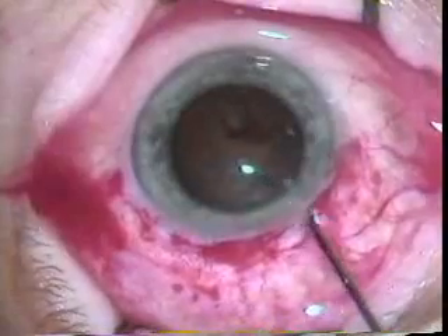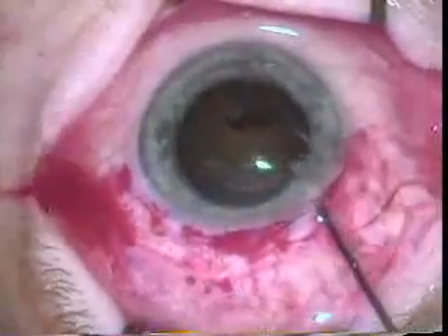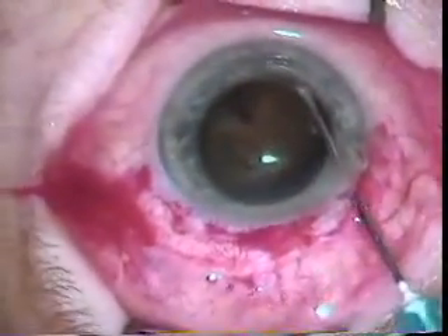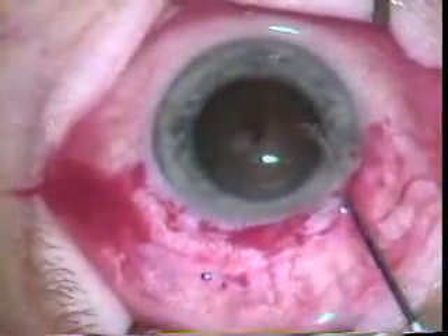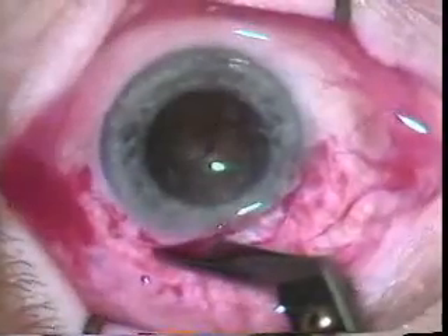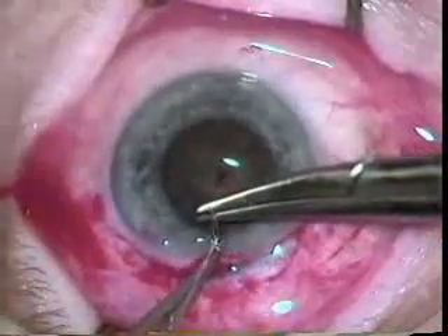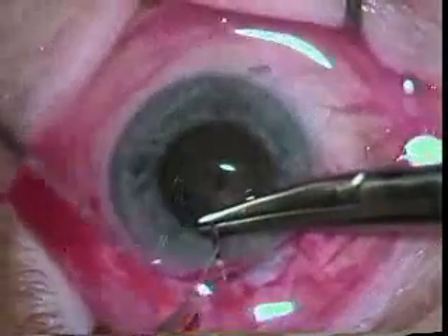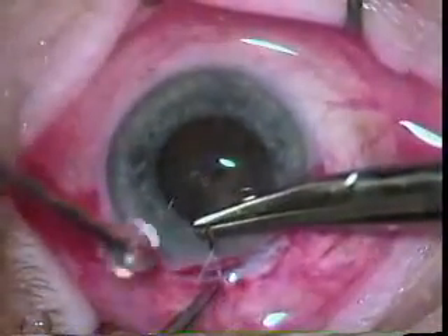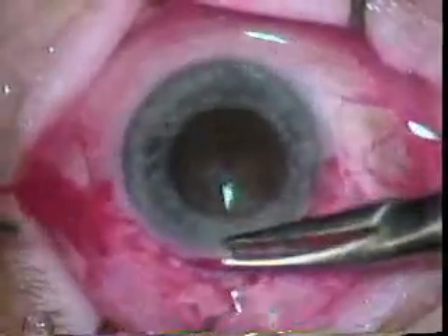Now this small section that was opened up for the rocking of the lens and for the capsulorrhexis is extended using what are called Castroviejo scissors, going in one direction. Here a safety suture is placed using 7-0 Vicryl, which would allow you to quickly close the eye should you have a choroidal hemorrhage.